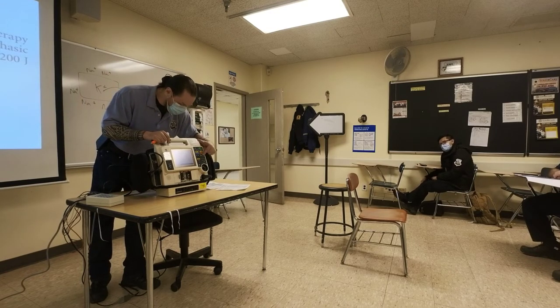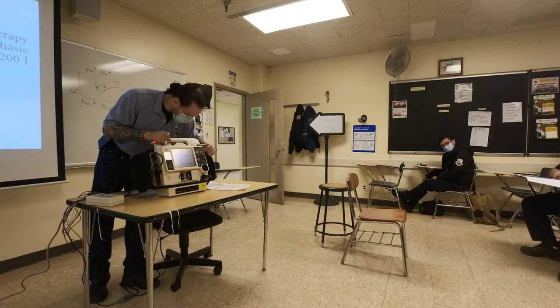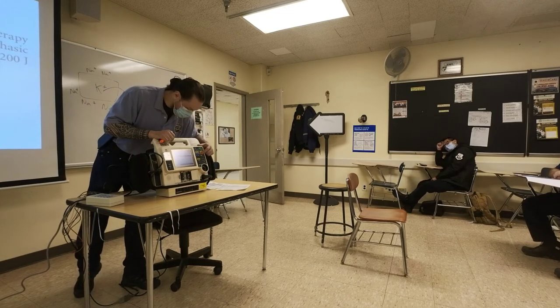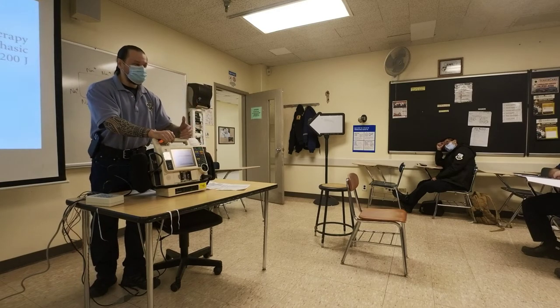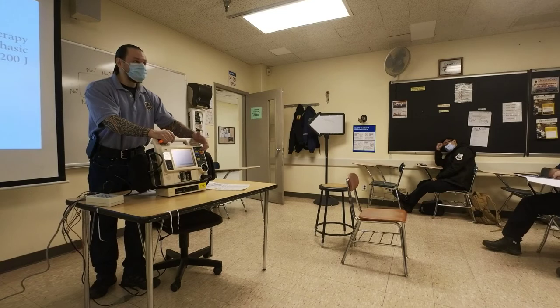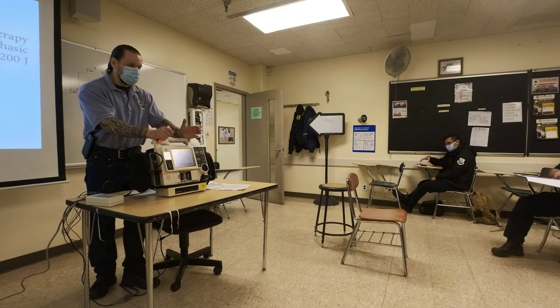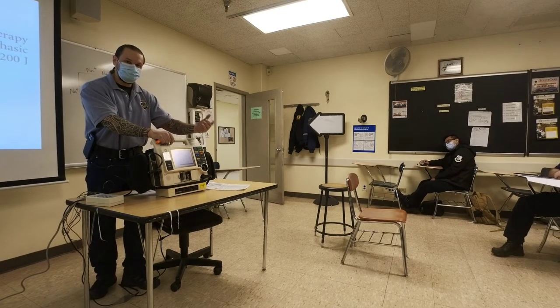On this monitor, you see sync engaged, then you charge. The moment I deliver this, it's going to dump. So I shock, and you see how sync disengages. If I had to go 200, I have to engage it again. If I just shock them at 200, then I defibrillate them. Do you know why this manufacturer did this? Because on the MRX monitor, it will stay engaged, but this one dumps it.